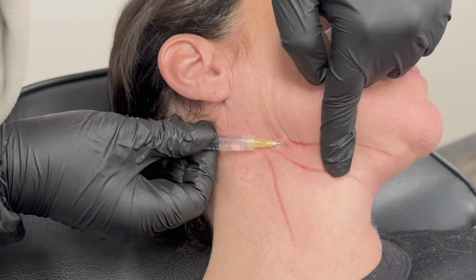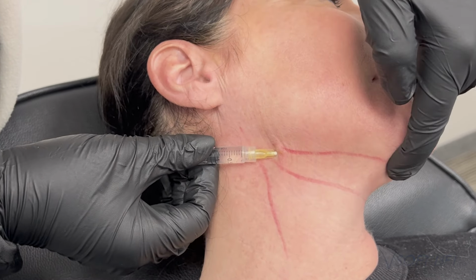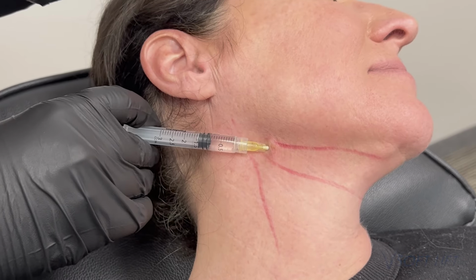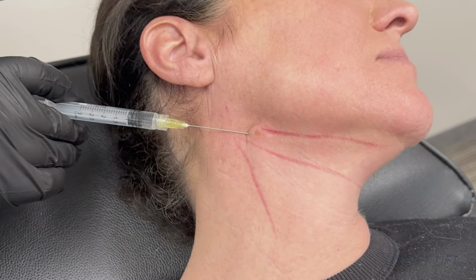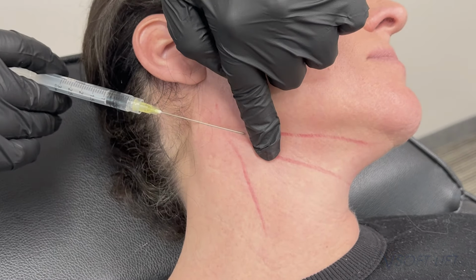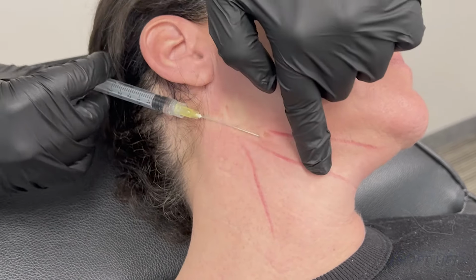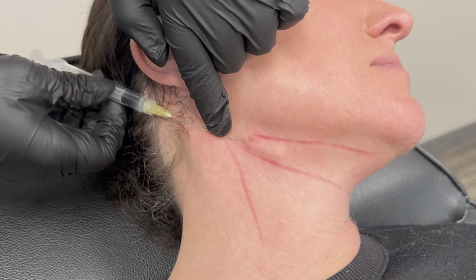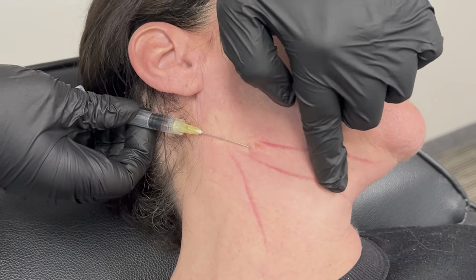So as you can see, the line going straight down her neck is to map out the anterior border of her SCM, because I always want to start anterior to that muscle. And then I do one thread directly under the mandible and then one a little bit lower, just to kind of grab that heaviest portion of the submental area.